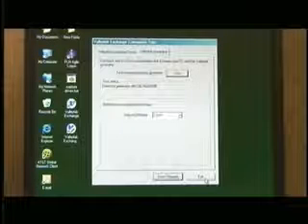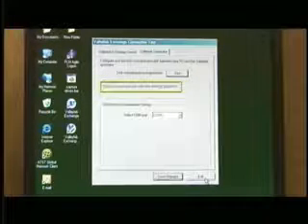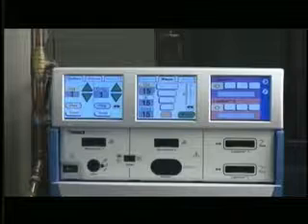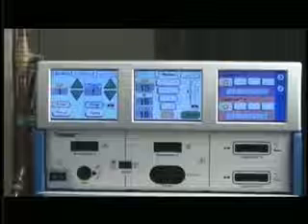If the service PC cannot communicate with the Force Triad Energy Platform, the test status will indicate Cannot communicate with the energy platform. Check your serial port settings. Verify that the RS-232 cable is connected and working properly, and that the Force Triad Energy Platform is turned on and has completed its startup routine. Also verify that the Force Triad Energy Platform has no error messages indicated on the screens. Selecting Exit will close the Valleylab Exchange Software Update System Connection tool.